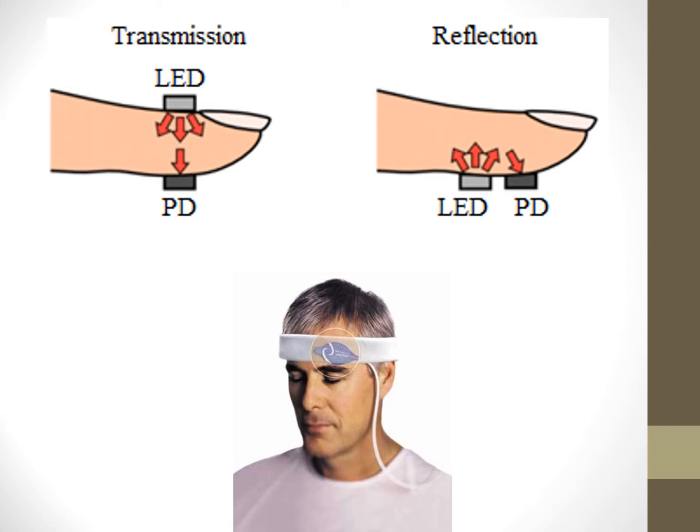The question I have is, what is the accuracy of the signal using the finger sticker and placing it on the forehead? Your accuracy may not be near what it is with an actual designed reflective pulse ox. You'll see people do the stickers all the time, lay them flat, put them on the head, and say, oh, I got a good signal. And I'm like, well, that's something, right? So just be very aware.